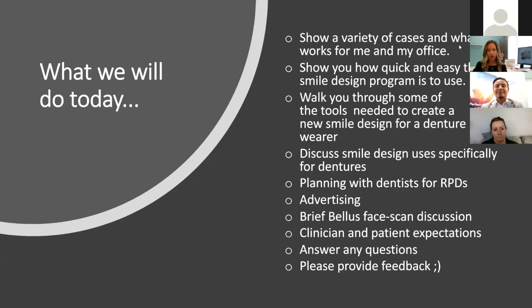So what I want to do today, this is just a quick rundown of what my expectation is for myself and for you. We're going to go through some cases. I'm going to show you a brief overview of the Smile Design application. This is denture specific, so I won't get into too much of what is available on there for you. I've sat in so many seminars during the COVID lockdown, and I learned a lot of extras. So there's lots there to be offered for you, but I think for denturists, for what we're doing with denture design, it's very easy and you don't have to get into great detail. And I think when you start looking at this, it can get a little overwhelming. So I'm really going to dumb this down for you.